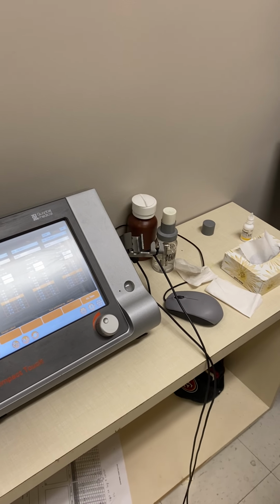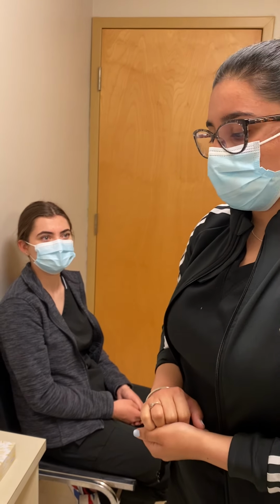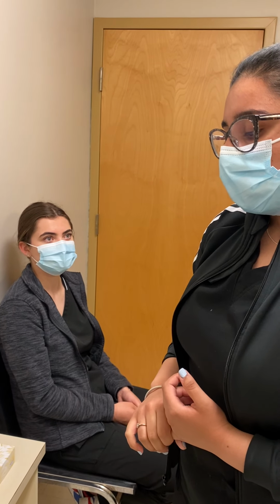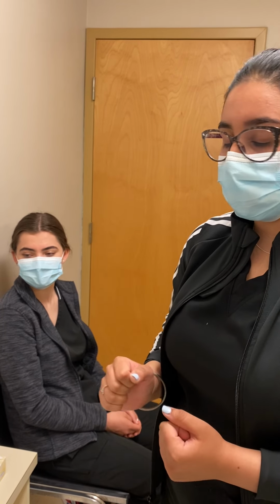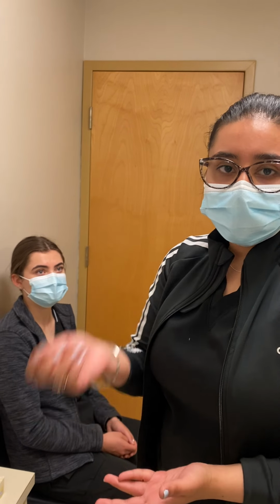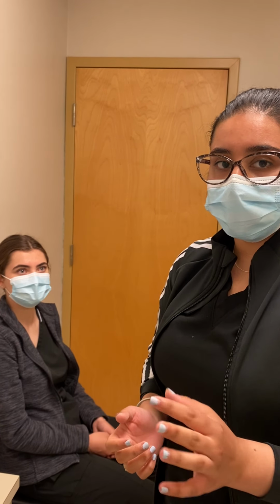With this, make sure you always put the freezing drops in the patient's eyes, otherwise you're going to be poking them pretty hard and they're going to be very uncomfortable. So make sure you always put the freezing drops in. Robin again was pretty good here. She could open her eyes well and she wasn't really flinching, but you're going to see a lot of patients who kind of get scared. Given something's coming at your eye, just make sure you open the eyes wide and get some help if you're not able to open it yourself.